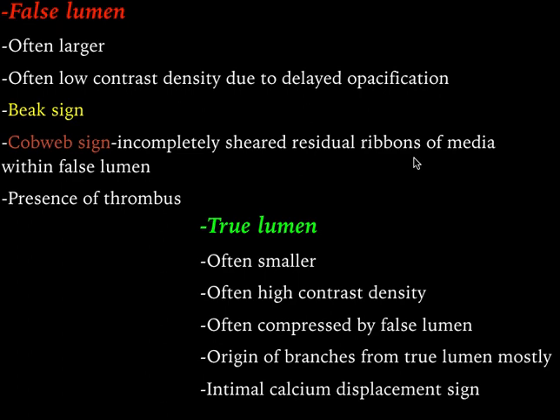This is a summary: the false lumen is usually larger, has low contrast density, shows the beak sign, cobweb sign, and presence of thrombus. All these features together give us the clue for identification of the false lumen. It is very important to differentiate the true and false lumen because it helps in management — specifically, which lumen the surgeon needs to enter to place a stent or perform an aortic repair.